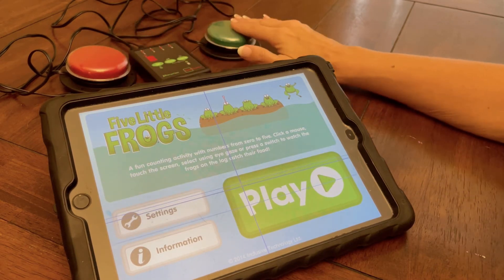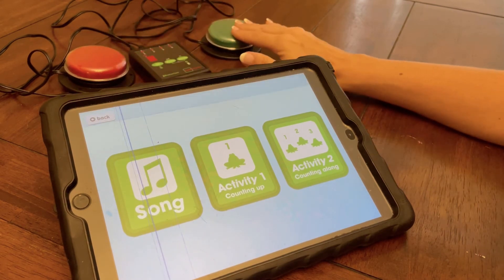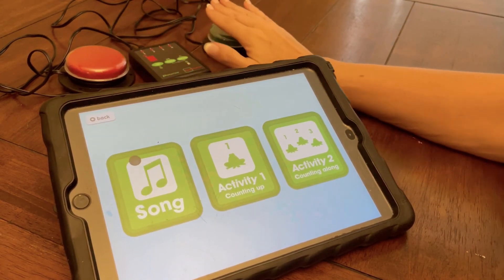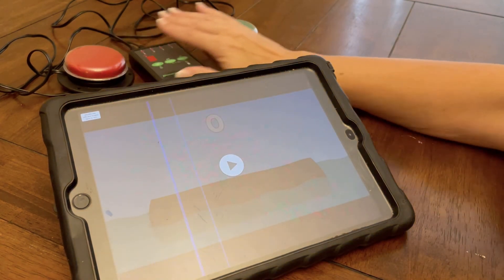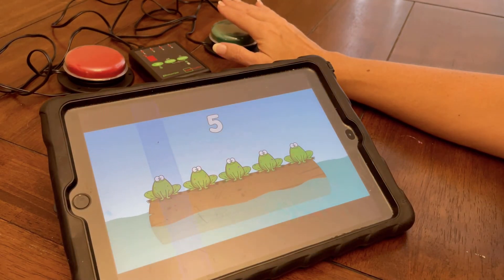I'm putting a cursor on the button I want and selecting, and making it go.